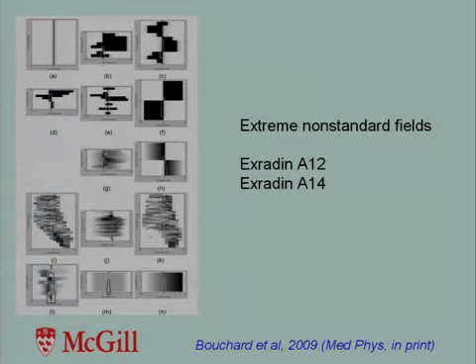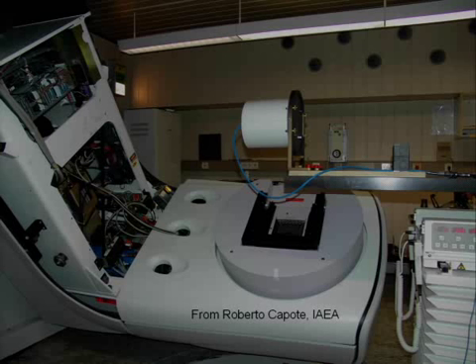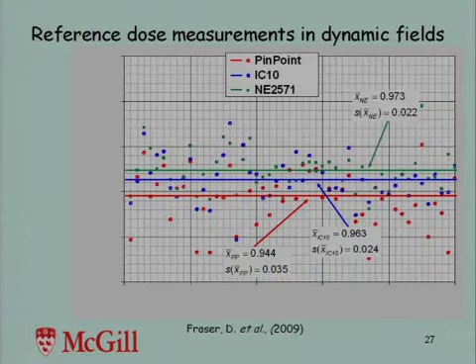So obviously, you would never in a clinic use a single field to do an IMRT dose measurement. You would use the composed field. So we have to come back to that. And that's shown here, where there's a typical QA measurement, maybe not so typical, but a QA measurement shown where a multi-field delivery is shown on a phantom, and the dose measurement would be performed in a high dose, low gradient area of the field. These kinds of QA measurements every clinical physicist is doing on a regular basis.